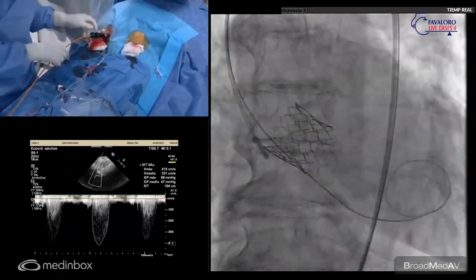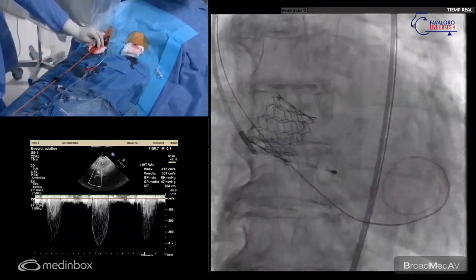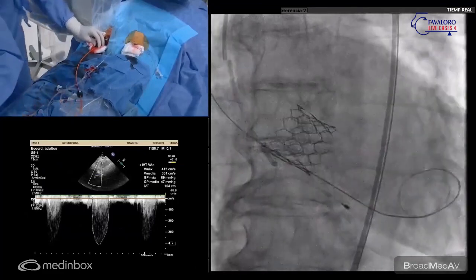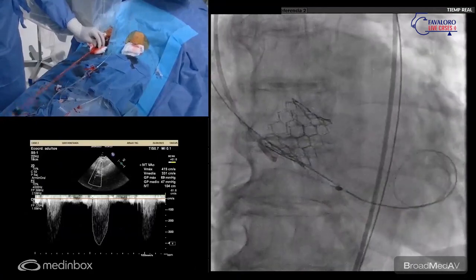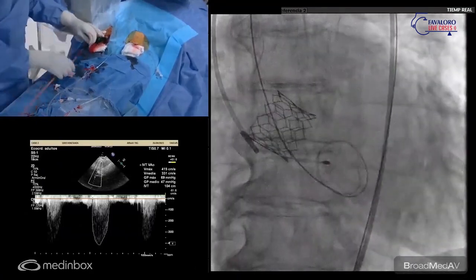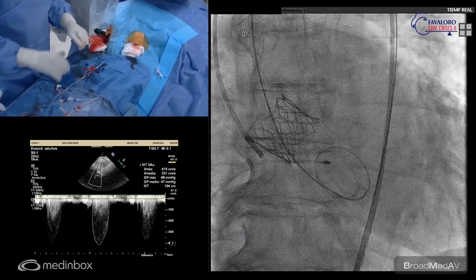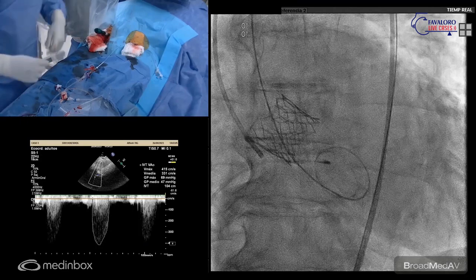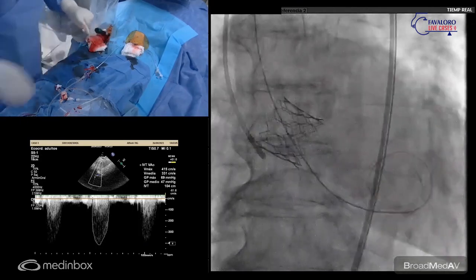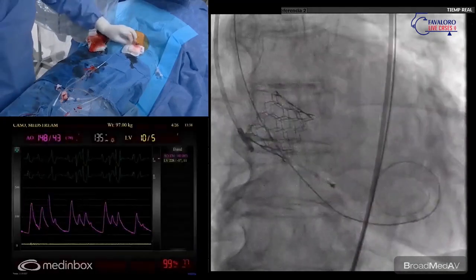Please retrieve, Carl, or hold it at the groin, because we have to pull hard. I don't want to hurt the doctor. So this is Carlos' hands. I mean, how easy the valve is. The balloon expandable valve, especially this valve, has good advantages in terms of aortic regurgitation. The AR has a very good sealing. And in these good sizes, it's very rare to have any gradient.